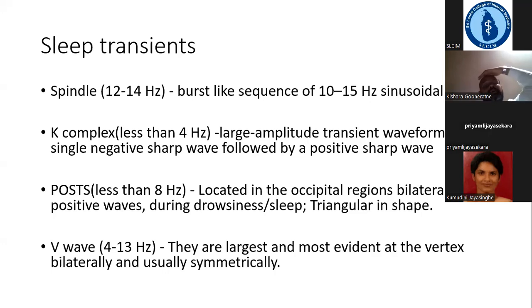So now we'll talk a little bit about sleep, because often in a 20 to 30 minute routine EEG, as I said, we try as much as possible to make these patients have a small nap during the EEG recording. And these are some of the physiological changes that can occur in an EEG. If the patient goes into the second stage of non-REM sleep, which is N2, they will have what we call spindle activity, right?